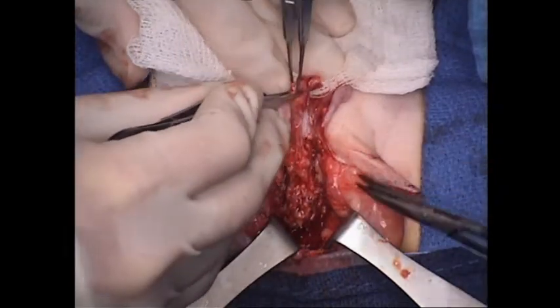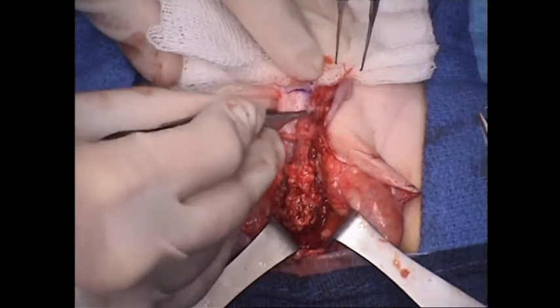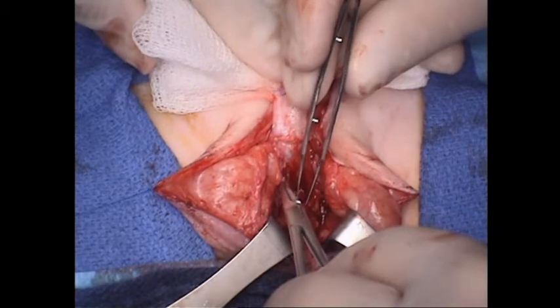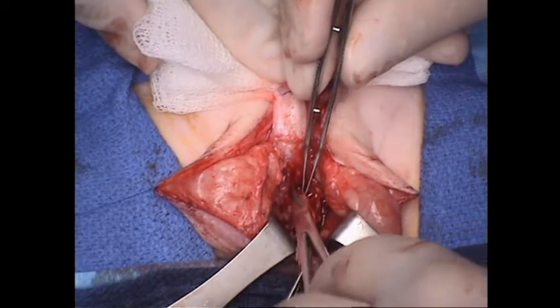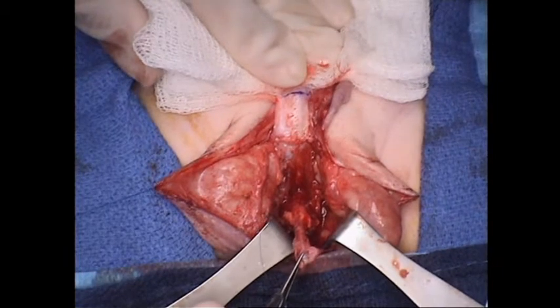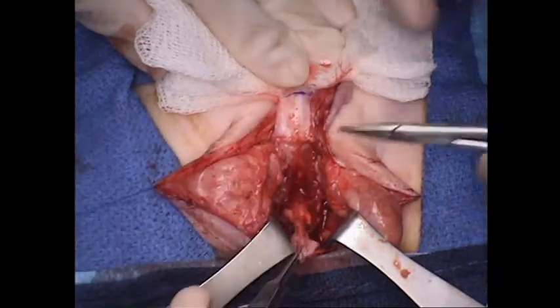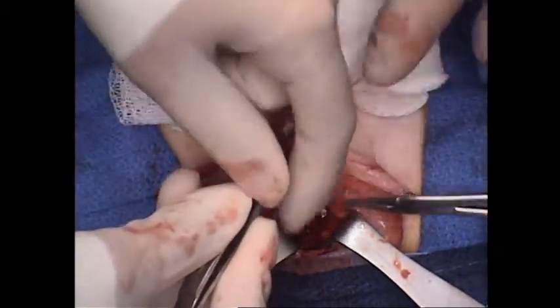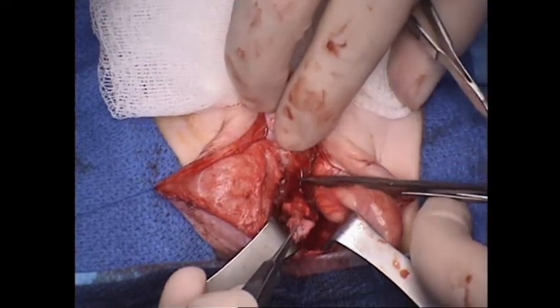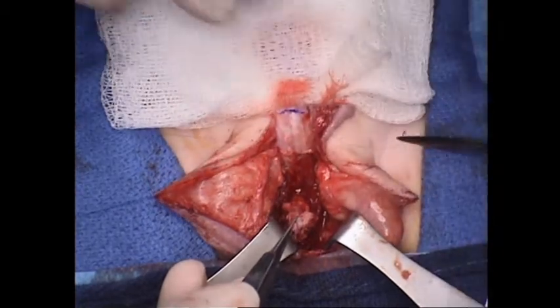We want to be sure that we're not twisting our urethra, so we're going to look at our native mucosa that was up here. That's the best way to orient yourself towards making sure that you're not putting any twist on it. And about every centimeter or so, we're going to place an interrupted 6-0 PDS to secure the native urethra and the urethral plate back to the corpora with some gentle stretch, but not much. You don't want to put so much stretch on this urethra that the urethra can recurve the penis.